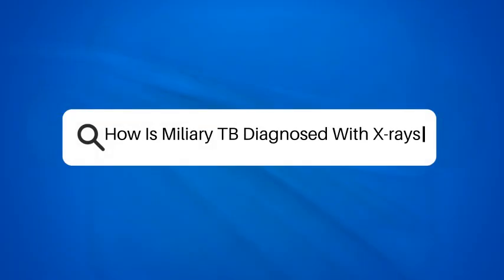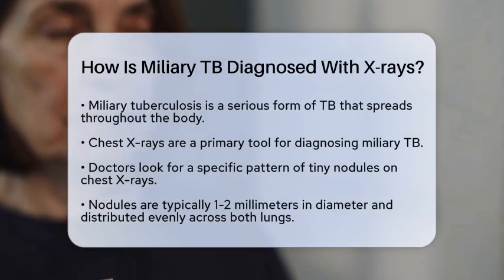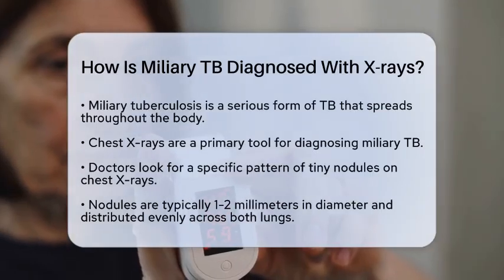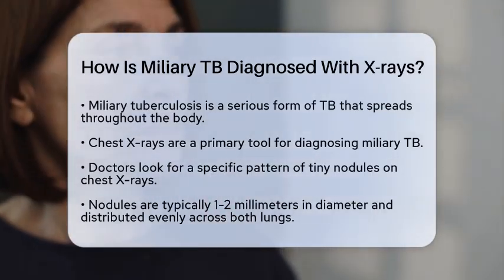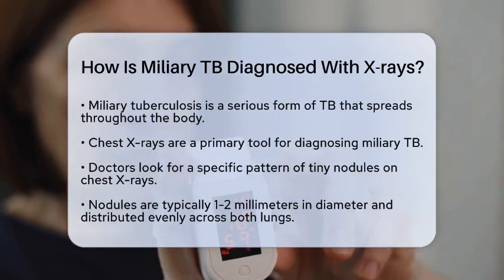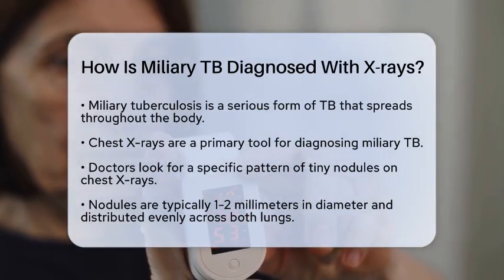How is miliary TB diagnosed with X-rays? Have you ever wondered how doctors diagnose miliary tuberculosis using X-rays? Miliary tuberculosis, often referred to as miliary TB, is a serious form of tuberculosis that spreads throughout the body.